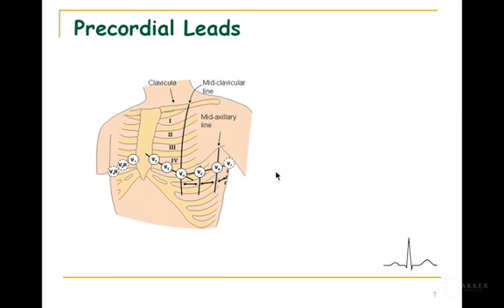But keep in mind that even though I'm going to call this a 12-lead ECG, there's only 10 monitor leads that are required. So okay, let's think about it. You got 6 on the chest. So just think of it as wires. You've got 1 on the right wrist, 1 on the left wrist, and 1 on the left ankle. That's 9. Okay, where's 10? The 10, you have a ground that's placed on the right ankle. So remember the one in lab that was the black one. There's a ground. So you have 10 wires, but you can get 12 different views of the heart.